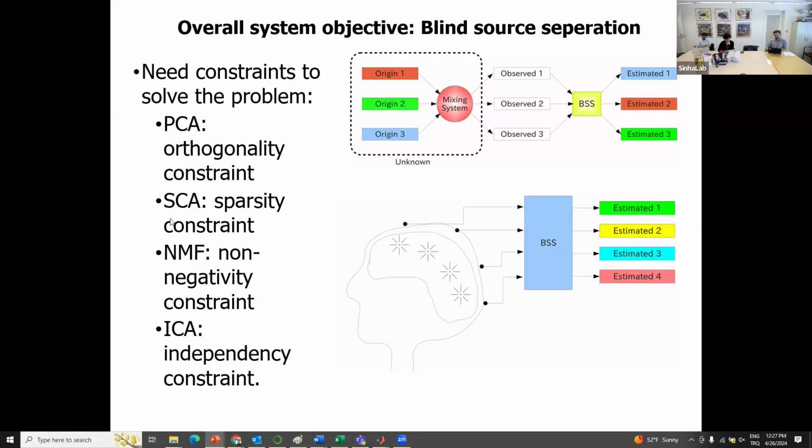So the sparsity constraint, or SCA, is a more practical, actually preferable solution to ICA, if your number of sensors, in other words your electrodes in our EEG context, is less than the number of sources. So you can actually come and say, how many sources? I have no idea how many sources I have. Yeah, that's a very accurate, very legitimate question.